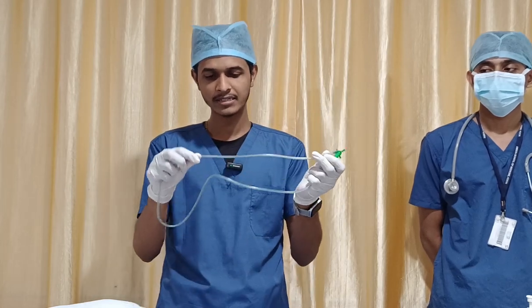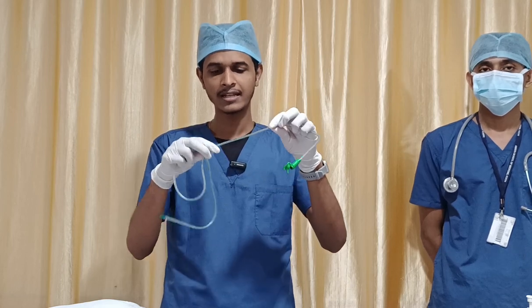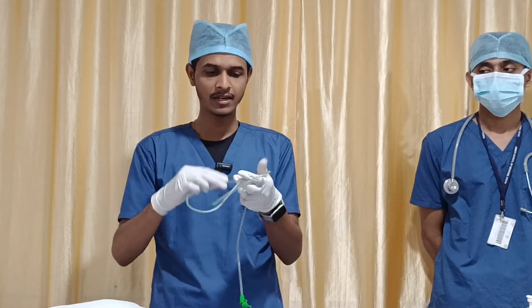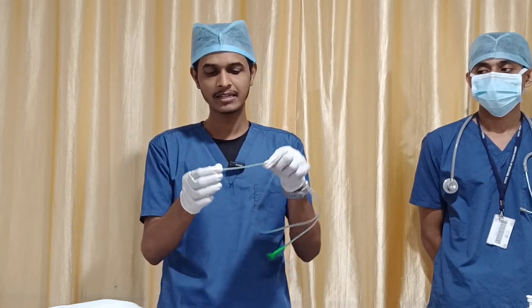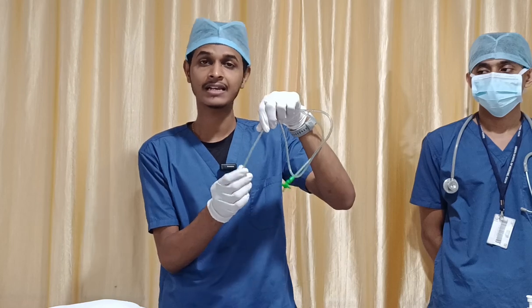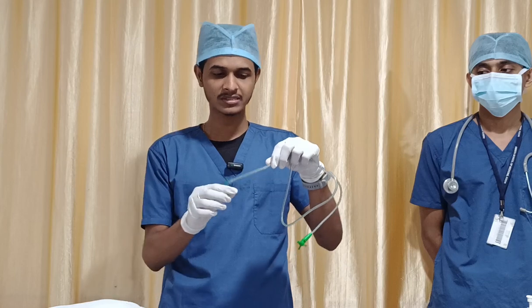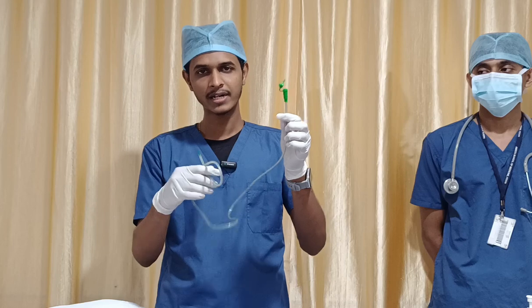Then here you can see the size, what French it is. This is 14 French. And then you can see the markings like 70 centimeters, 80 centimeters, that range of markings will also be there. In the distal portion you can see this blunt end. And in the distal lateral region you have some holes, some cavity-like region, this is called the lateral eye. This only facilitates your feeding, or if you are doing decompression, this part will take a role.